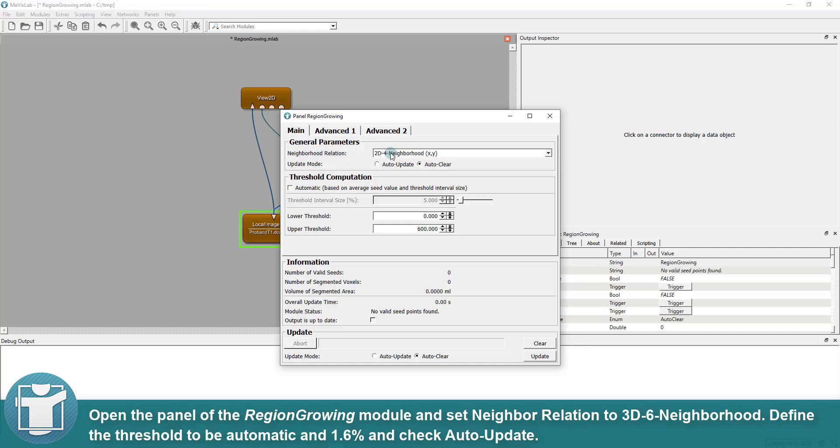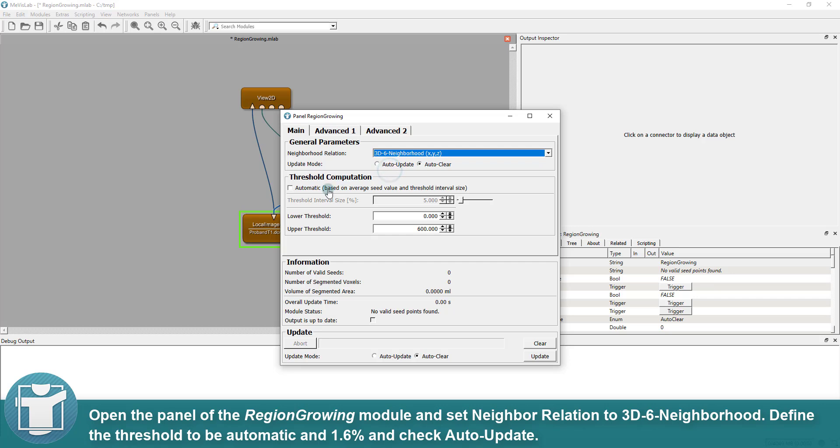Open the panel of the region-growing module and set neighbor relation to 3D6 neighborhood. Define the threshold to be automatic and 1.6% and check auto-update.